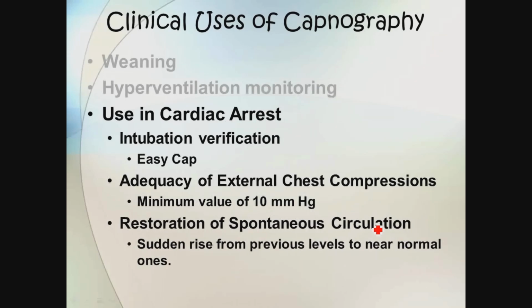But now, again, we're looking at external chest compressions where normal end-tidal CO2, this is what AHA says, 35 to 40 millimeters of mercury. I think we learned a little bit different value than that, but okay, whatever. Again, this is AHA. And their recommendation is whenever you have a value that's falling below 10 millimeters of mercury, you should get a new rescuer onto chest because they're not doing effective compressions. If you don't do effective compressions, you're not circulating the blood, blah, blah, blah.